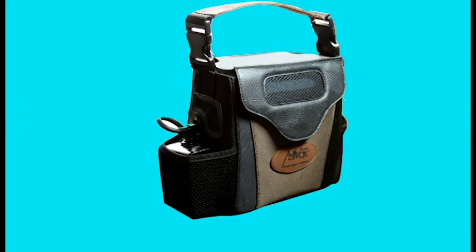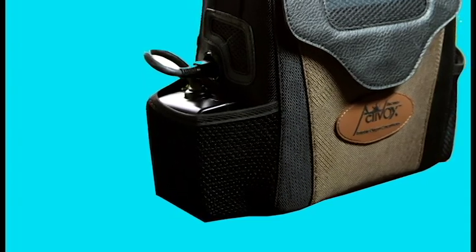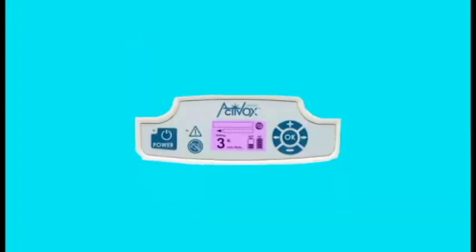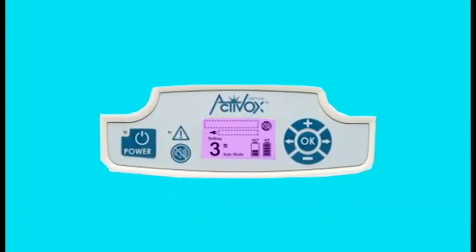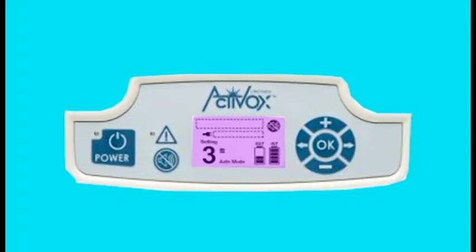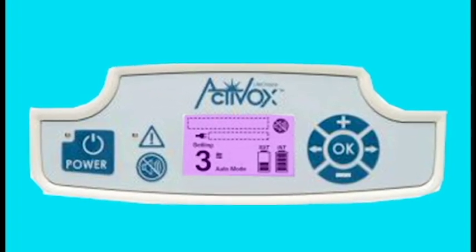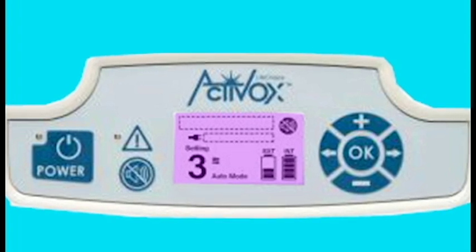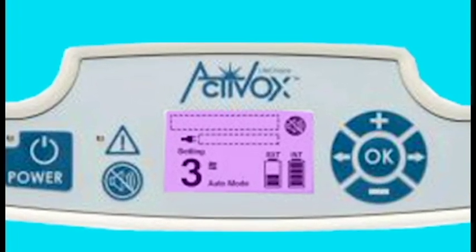It does come with a side pocket to fit the small external battery on that custom carrying case. They are also introducing the new trans-reflective display which is very easy to see in bright sunlight or in the dark. It's very nice to have a digital display there to show any type of alarms, what setting you're on, your external and internal battery life — all the good stuff that was on the old units is now on this digital display on the Activox 4L.